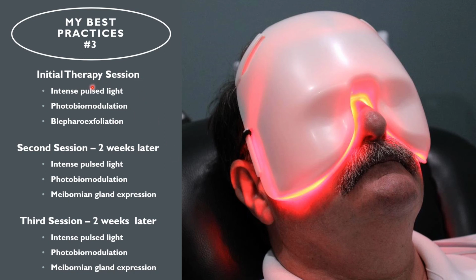Then two, and that's a lot. It's a lot of work. It's a lot of mechanical trauma on the lids. That skin is real delicate. It's thin. You know, this is max therapy to me. I mean, we're banging them now. I'm sledgehammering, we're jackhammering them now. This is strong. Okay, this is a strong approach. Extremely effective. Extremely effective. So IPL, mask, clean the lids.